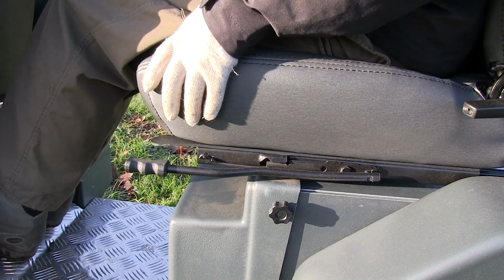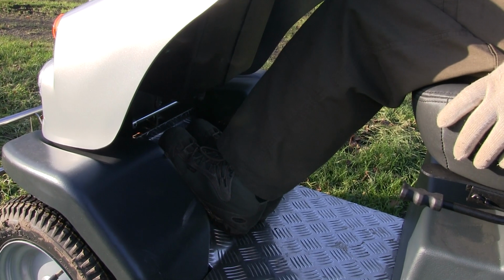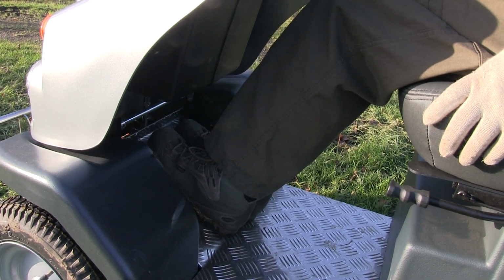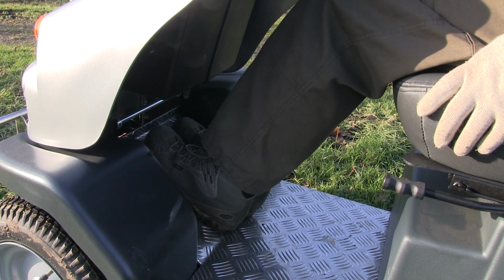And get that in a position where your feet are nice and flat on the angled bit of foot plate. That means that your feet will stay within the Tramper and you'll not be tempted to put your foot outside of the Tramper when you're in motion.